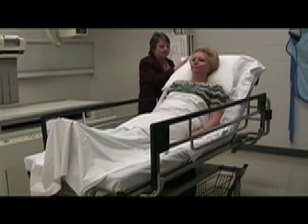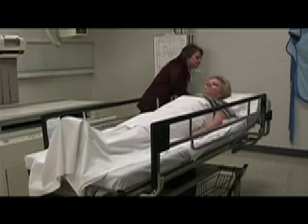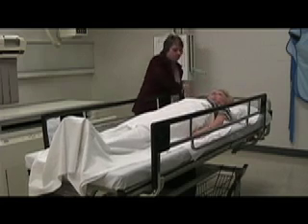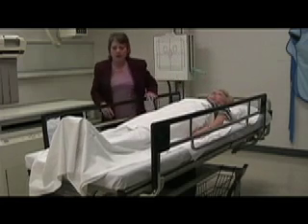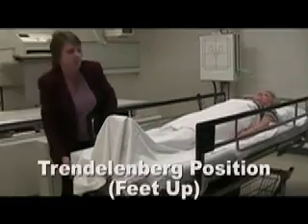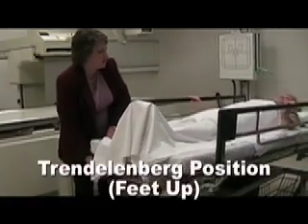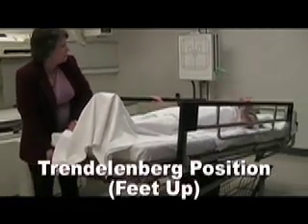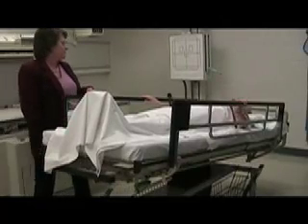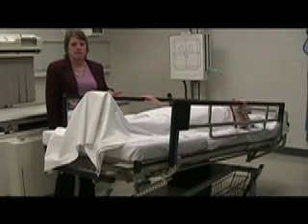Now we're going to lay you back down and lower the head this time. This will be Trendelenburg — the feet are going to be higher than the head. Hold on tight. This is Trendelenburg position.